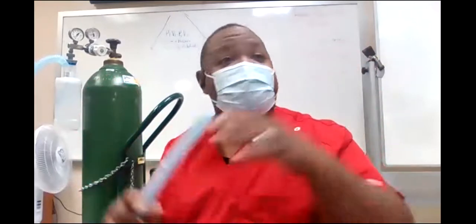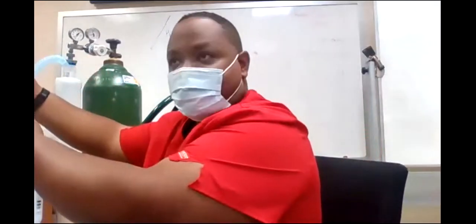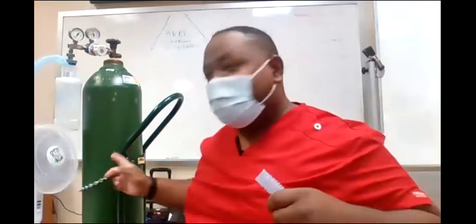Because when they get to the post, you always want to wean them off the oxygen, right? So say he started out at 40%, you got him down to 28%, he's doing well. We're going to unscrew this and hook it to the air now because he doesn't need oxygen anymore. He's healed enough to not need oxygen, okay? But he still has an artificial airway. I can't just blow a nasal cannula on here. I have to give him the moisture. For him, it will be the trach collar. So he's going to be on aerosol trach collar at 21%.